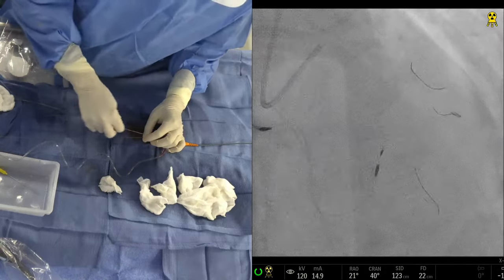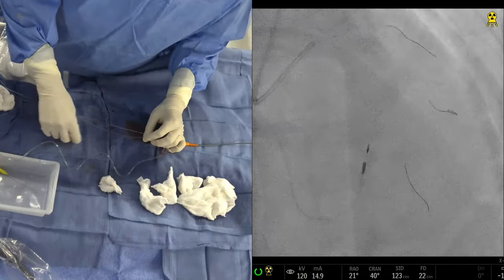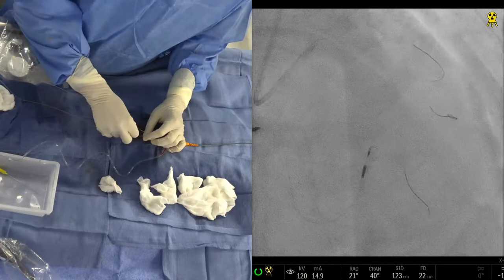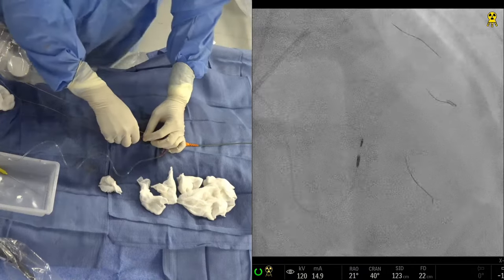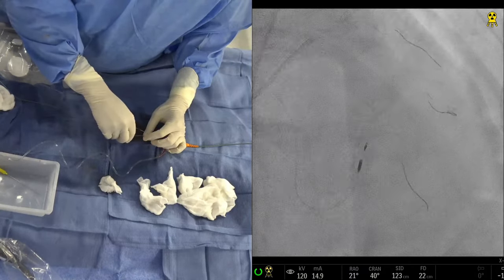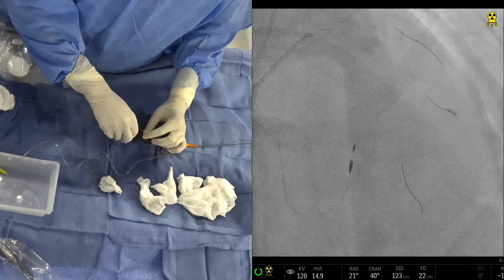The calcium score, plus or minus, gives you some idea where that patient will be. But the key is the stress test will go down. Symptoms alone you cannot rely on, particularly in a patient who is diabetic, like this particular case. Although this patient has a symptom, so this is a totally different story. And the role of CT will still remain.